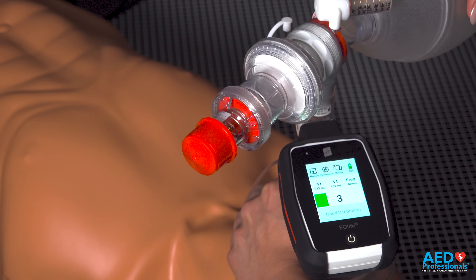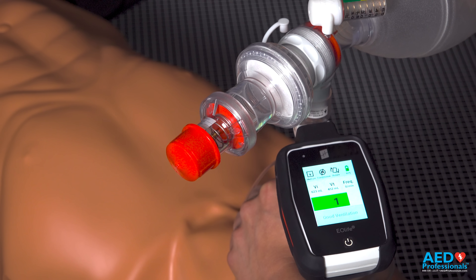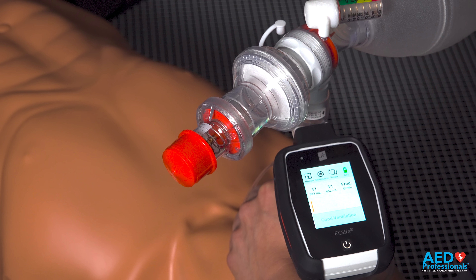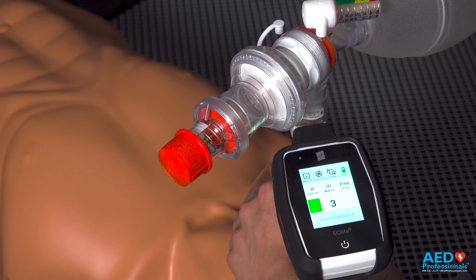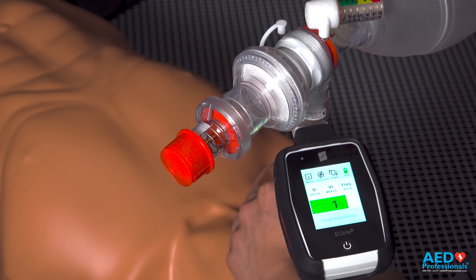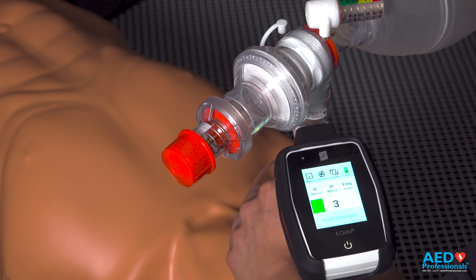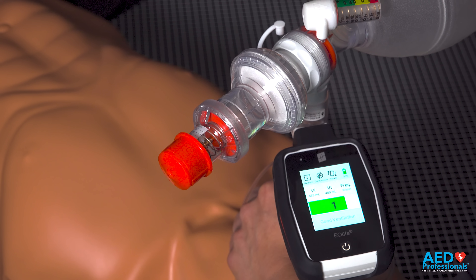Showing that we have some important leakage — good ventilation. Now we have about 533 milliliters going into the patient and about 464 returning back as our VT. As long as you're between 450 and 550, you're doing a pretty good job.